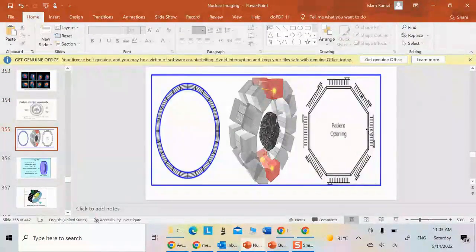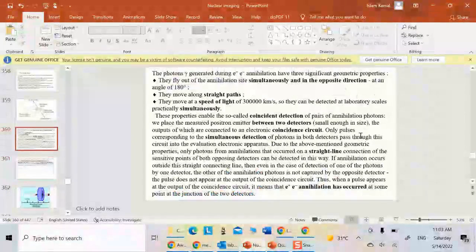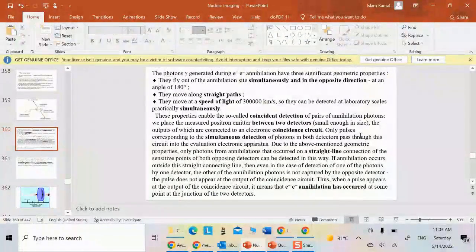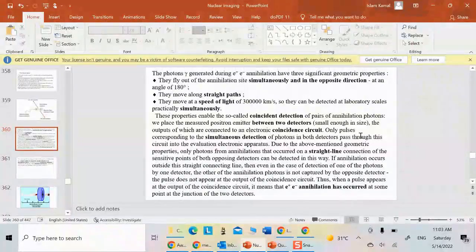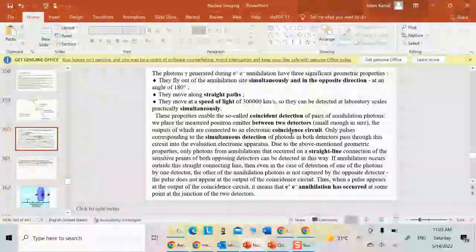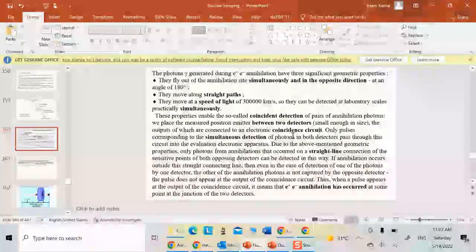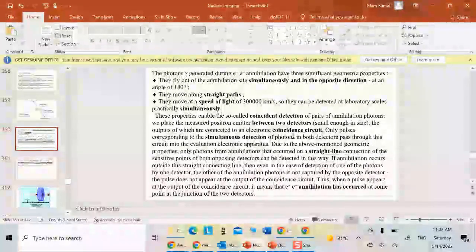If you remember the PET/CT discussion, we mentioned that I am working with an isotope, which has different characteristics compared to the technetium. It relies on a completely different mechanism of conversion, where I have a material that contains an excess number of protons. The proton converts to a neutron, producing a positron. This positron undergoes annihilation or interacts with the nearest electron, resulting in two gamma photons emitted at 180 degrees to each other.